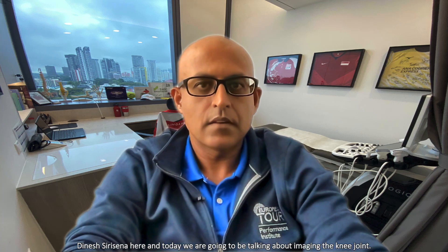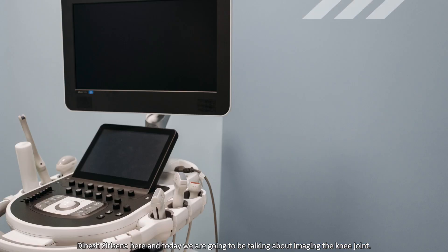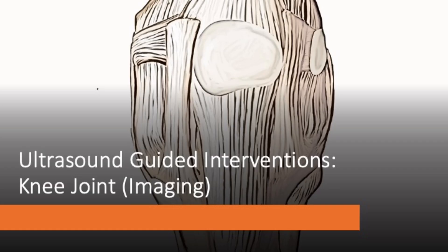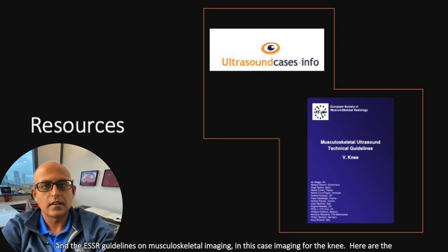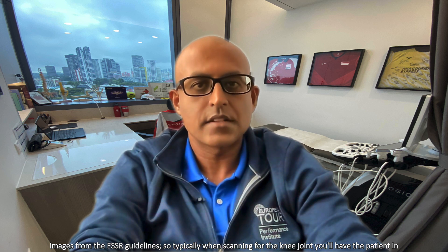Hi everyone, Dinesh Siracena here, and today we're going to be talking about imaging the knee joint. As with my previous talks, I recommend two resources: ultrasoundcases.info and the ESSR guidelines on musculoskeletal imaging, in this case imaging for the knee. And here are the images from the ESSR guidelines.